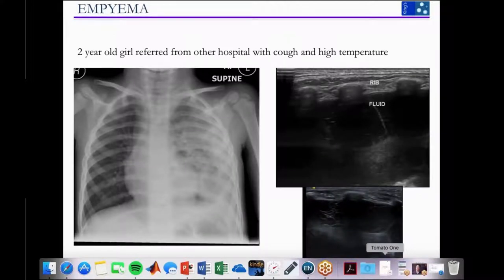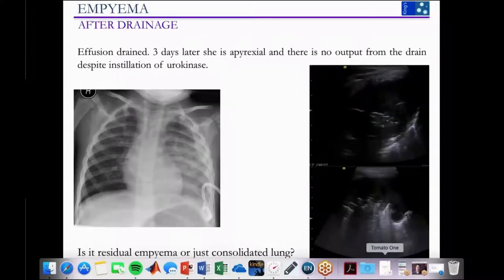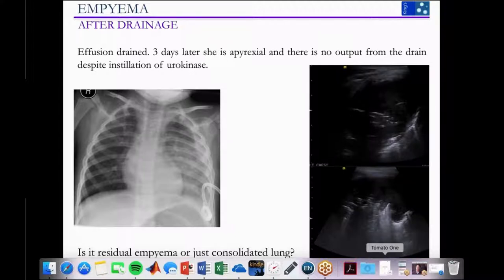A two-year-old referred from another hospital with cough and high temperature showed a necrotizing pneumonia on chest X-ray with opacification of much of the left lung and a left-sided effusion. Grayscale ultrasound showed a multiseptated effusion; a pigtail catheter was inserted and the effusion was initially drained. Three days later, the child was apyrexial, there was no output from the drain despite instillation of urokinase. Grayscale imaging made it difficult to assess how much was lung versus underlying empyema, with the drain now no longer draining. The risk was whether to remove the drain prematurely.